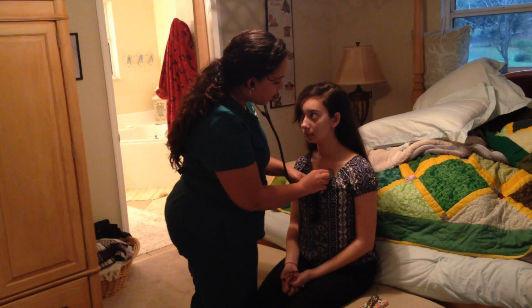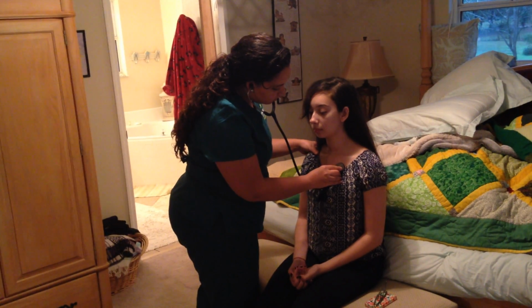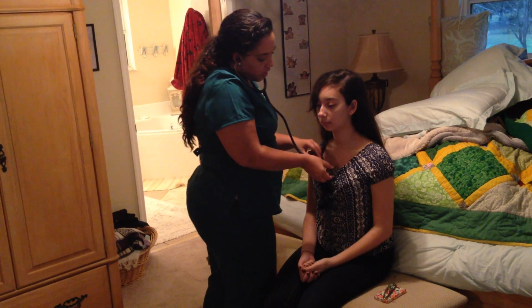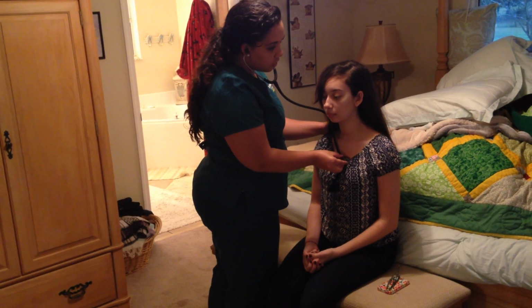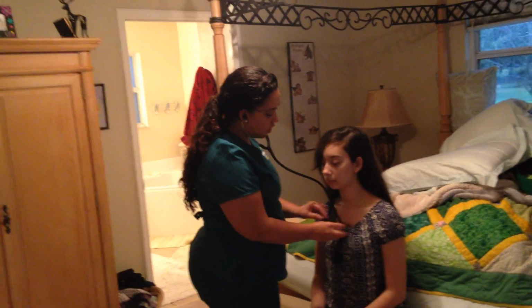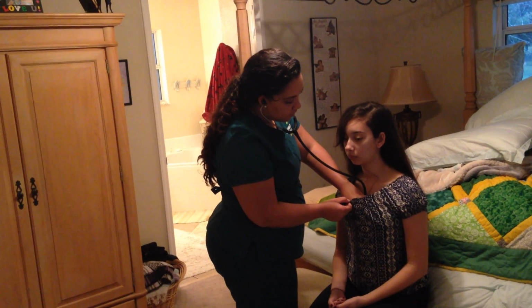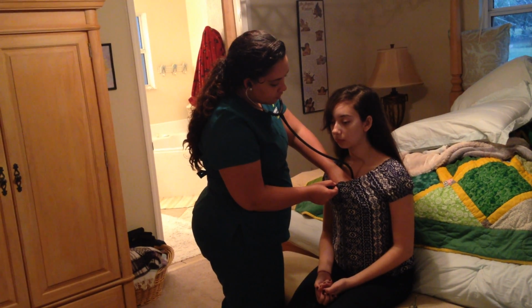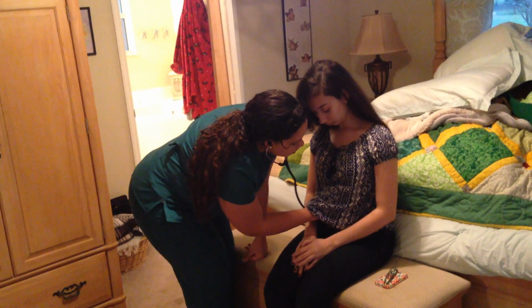And the next one is the pulmonic valve, and that is in the same direction on the other side, in the second intercostal. The next thing I'm going to be listening for is the Erb's point. And this is where the S1 and the S2 are, and that is the third intercostal down. Okay. And then a little bit further down is the tricuspid valve. Okay. And lastly, I'm going to go underneath your shirt. I'm going to listen to your mitral valve, which is right underneath the bra line.